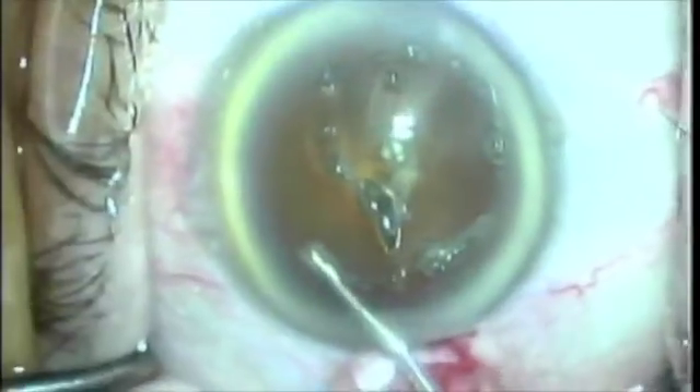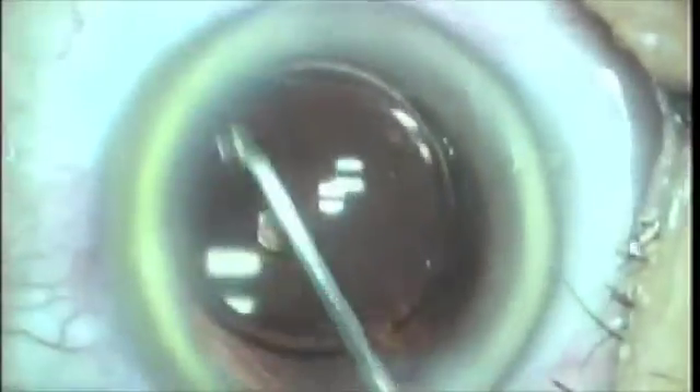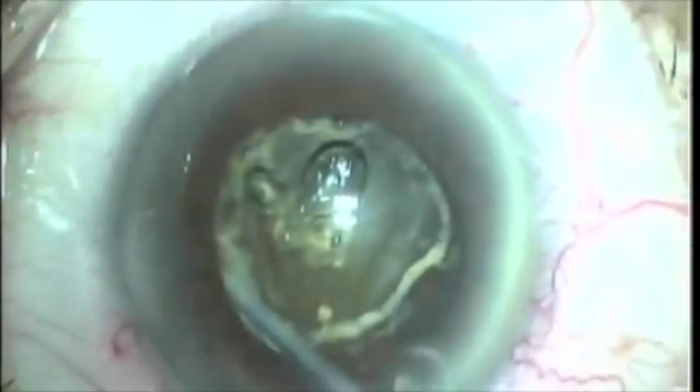Here's a patient — just a standard capsulotomy, nothing heroic about this. I'm just walking along, gently walking along the pupillary margin. Look at the spring — even though you have this large capsulotomy, you have fantastic spring because there's good placement, as I explained in the first video.